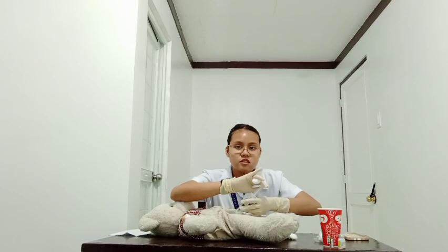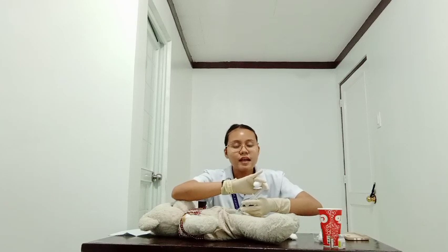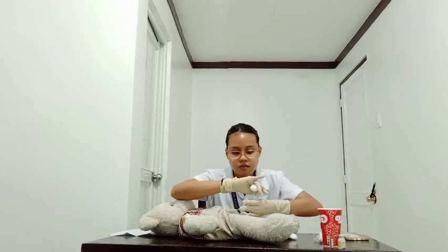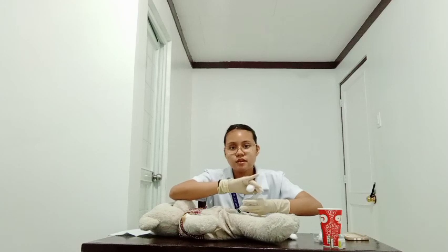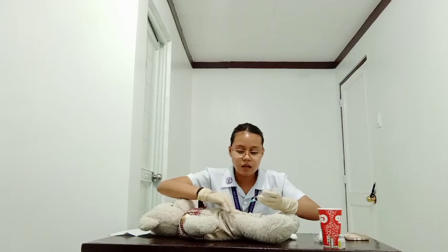Okay. So now, inject the medication by holding the syringe steady and depressing the plunger with slow and even pressure for support and easier injection of the solution. So, injecting now. So, remove the needle. If bleeding occurs, apply pressure to the site with a dry, sterile gauze until it stops. When withdrawing this, withdraw with the same angle as we inserted it. Okay, now we need to apply pressure.